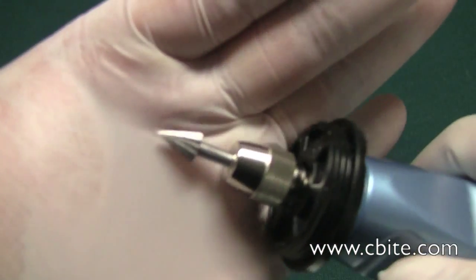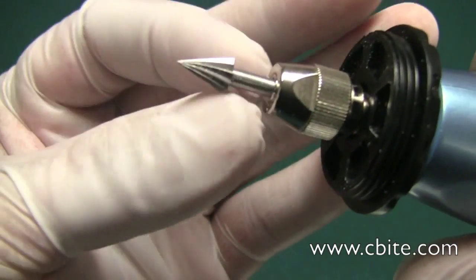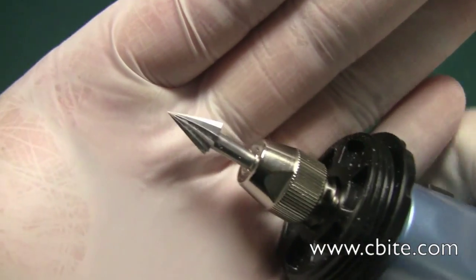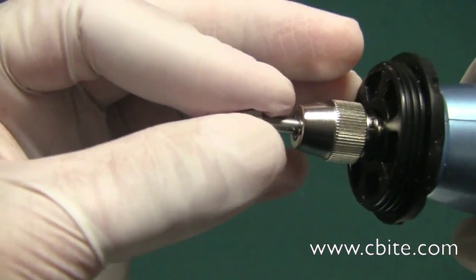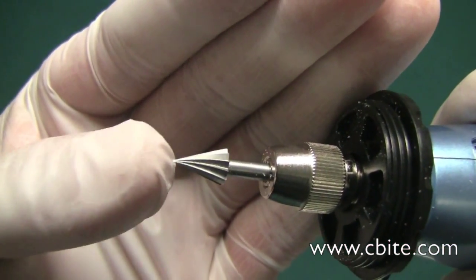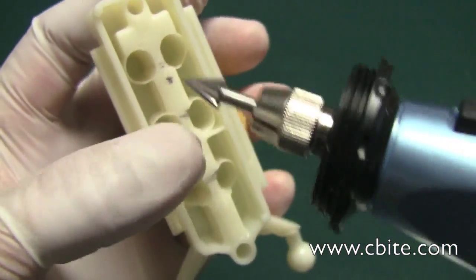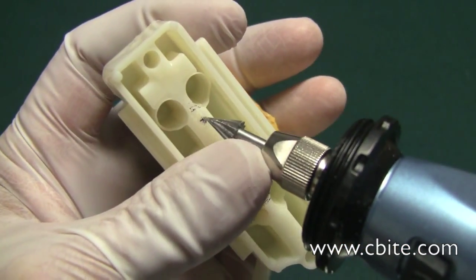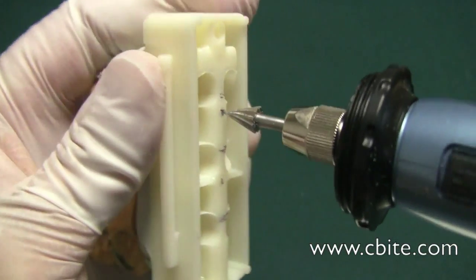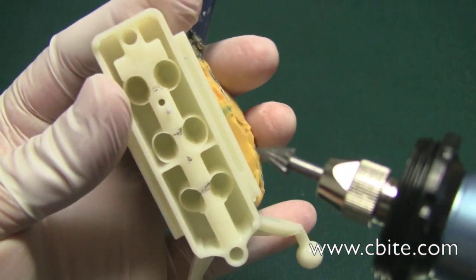This Dremel has a special type of burr — it's a high-speed cutter. It does the job well for making a hole in plastic without getting it all gunked up, and it has a real sharp point so it stays in place. Basically, I just hold it in place and spin it, and it's made that hole. I do the same for the other one — hold it in place, and it does that very well.